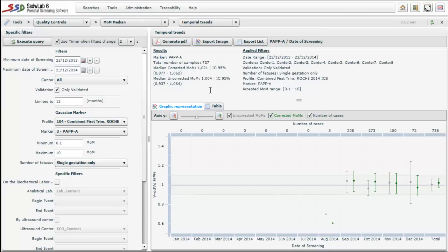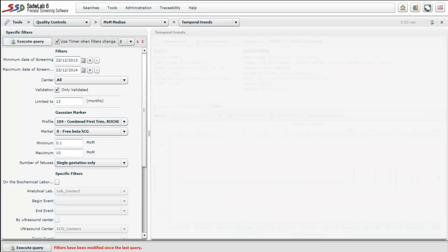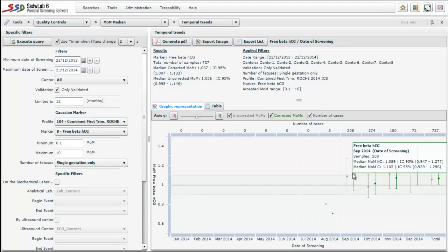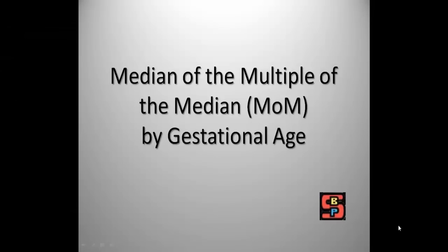These values lie between 0.9 and 1.1, which corresponds to 10% of the value of 1. We can analyze another marker such as nuchal translucency or free beta-human chorionic gonadotropin. For free beta hCG, the median corrected MoM is 1.067 and the median uncorrected MoM is 1.056. We note that in September the medians, both corrected and uncorrected, were at the limit of their acceptable interval. The median of multiples of the median can also be analyzed for different gestational ages or weeks of gestation, or in the case of nuchal translucency by different fetal lengths.